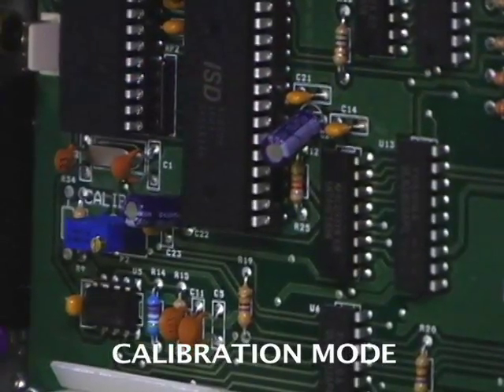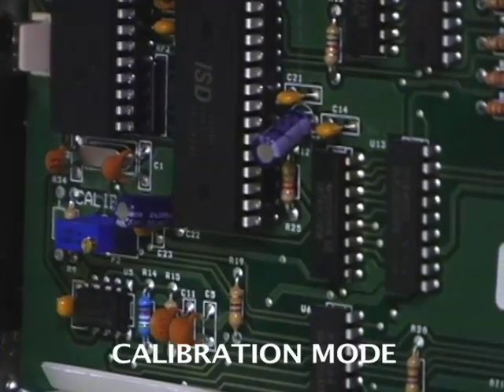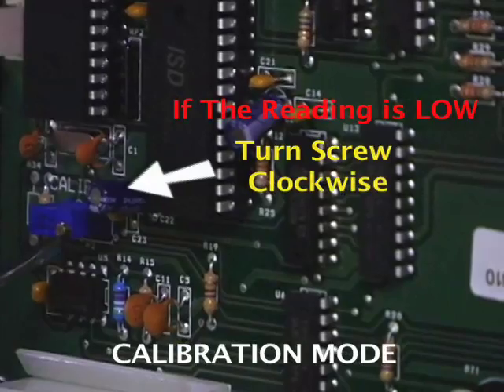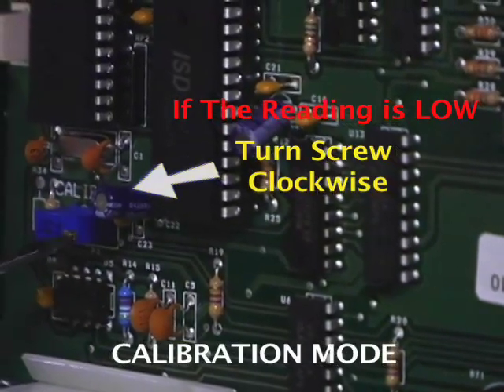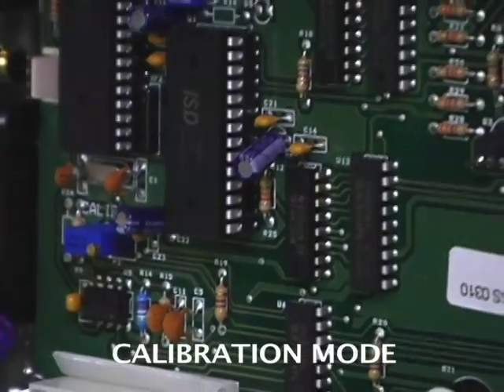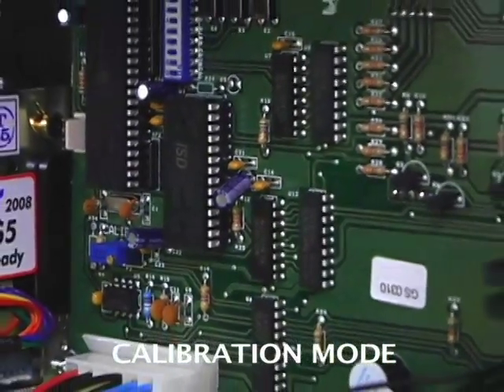For example, if the reading blew lower than 0.33 — say a 0.21 — then we need to turn the screw clockwise. So if the reading is too low, turn it clockwise. If the reading is too high, turn the screw counter-clockwise.